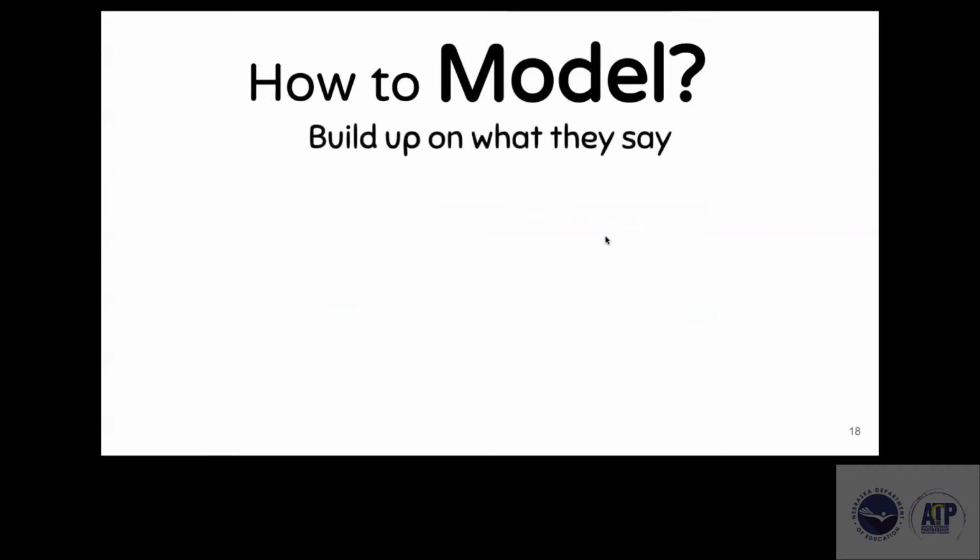And then I love build up. Build up is something we do so often with our students, and it's so helpful for showing them how to expand their language and use their device to expand that language or board. Again, without making them repeat it. We never want to make AAC or core vocabulary use ever seem like work, and I'll talk about that in a moment. We always want to make it as fun and natural as possible.